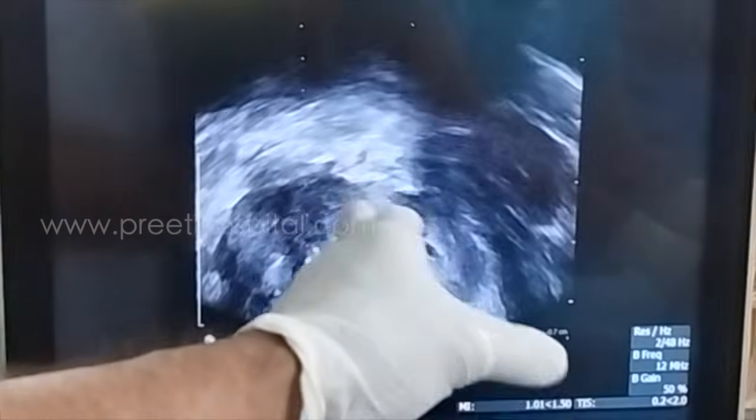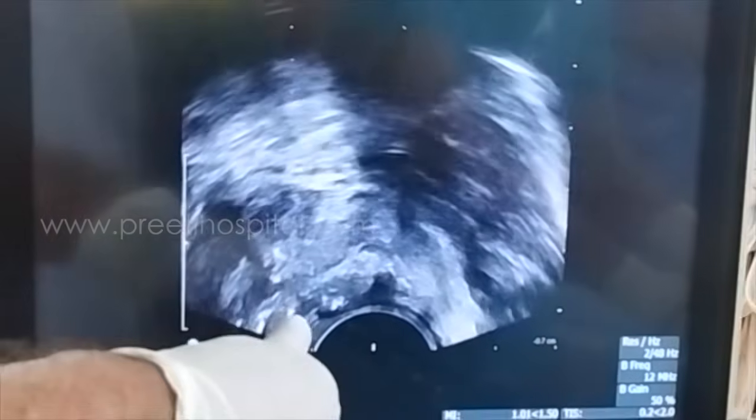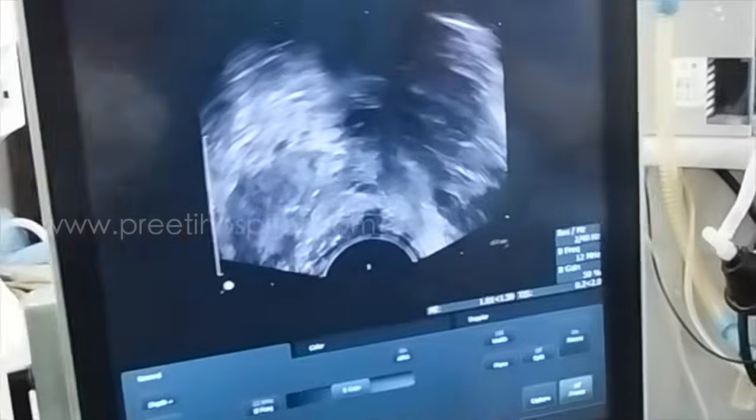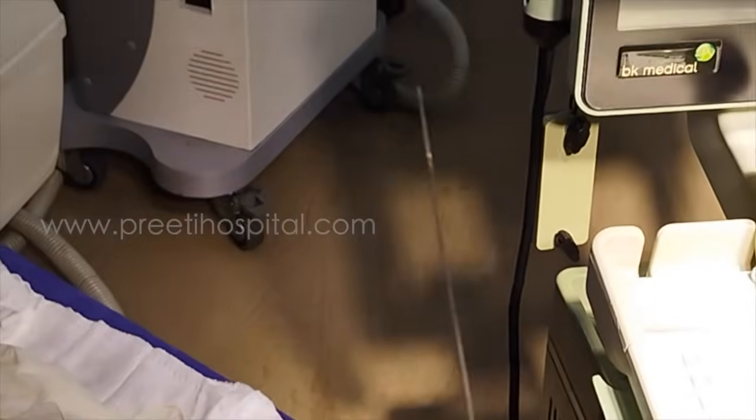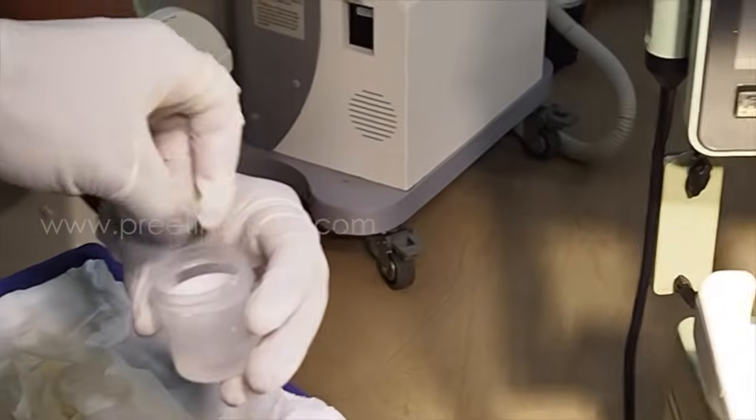Here, a little more this side. Yes. This is the needle coming from the rectal mucosa and it fired. This is the right side. This is the 11th piece. Nice piece has come. Right side, medial.